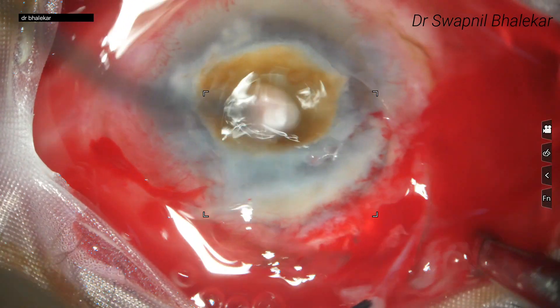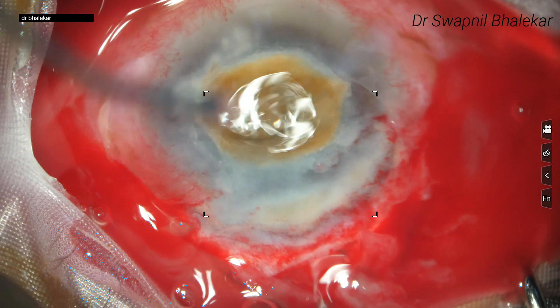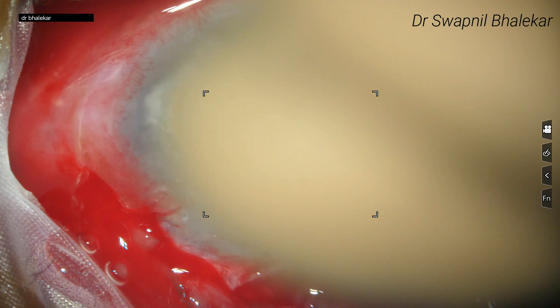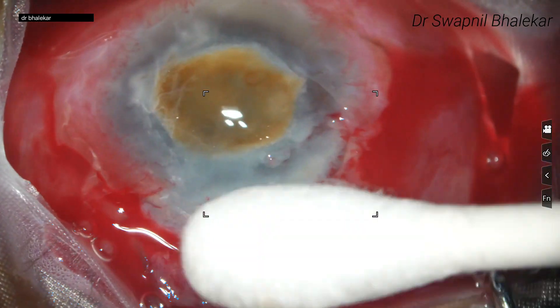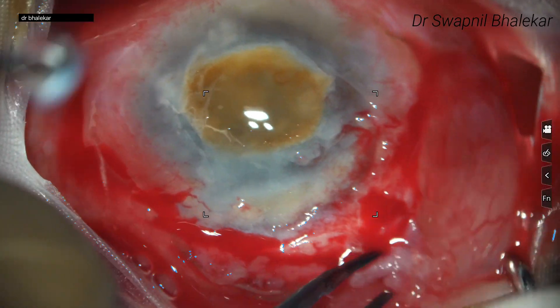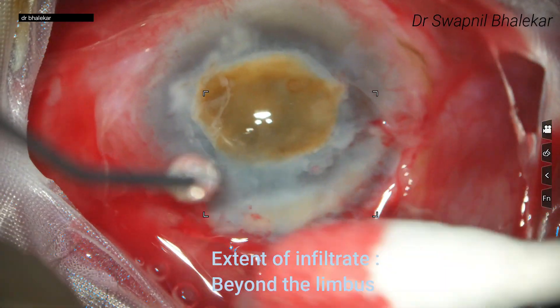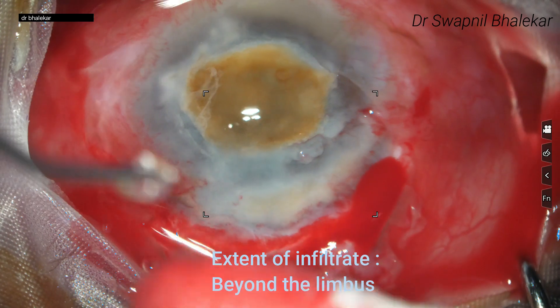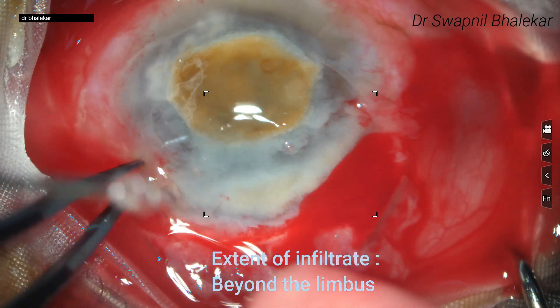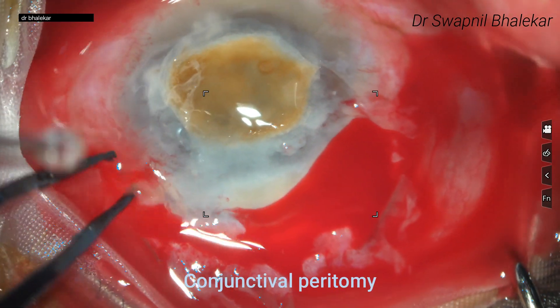Examine the cornea for the extent of infiltrates and areas of thinning; any peripheral areas of thinning should also be noted. Here, you can notice the extent of the infiltrate is beyond the limbus, and hence I am doing a 360-degree conjunctival peritomy.